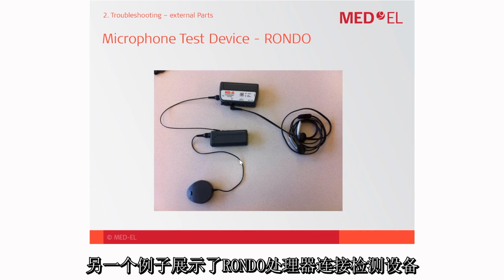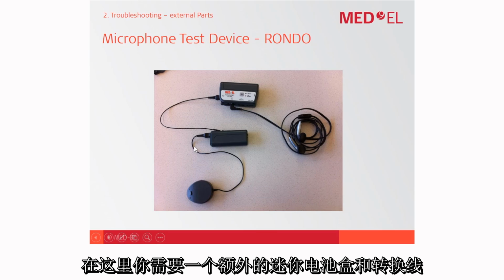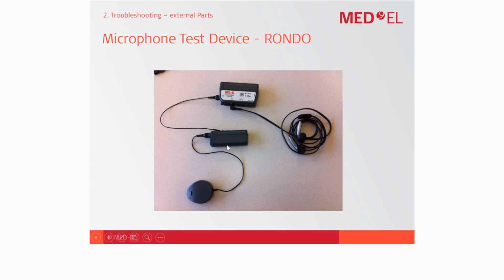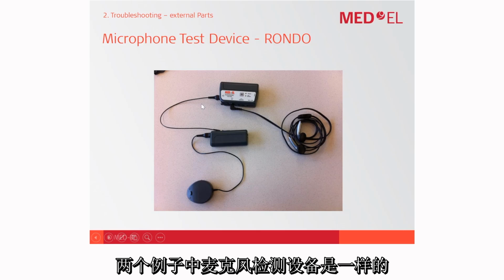So this is another example showing the microphone test device in combination with the Rondo processor. In this example you need an additional mini battery pack and an adapter cable, which allows you then to monitor the microphone signal of the Rondo via the test device. The test device itself is the same.